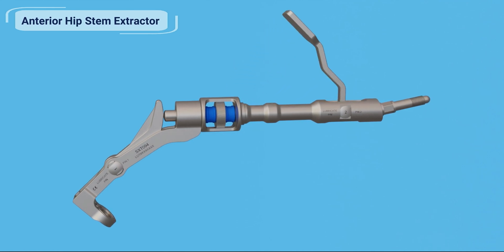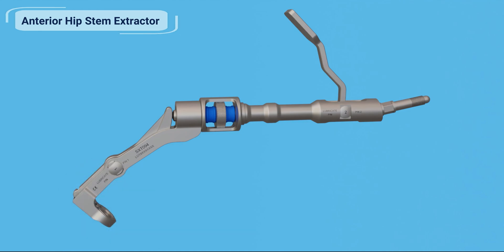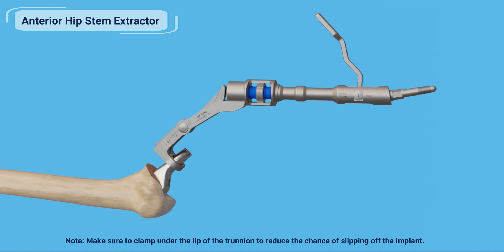To use the femoral hip stem extractor, open the cam handle and then rotate the adjustment knob to fully open the extractor jaw. Then push the rocker lever backwards towards the distal end of the extractor — this will slide the movable jaw to the open position. Next, slide the open jaw over the trunnion of the femoral hip stem.